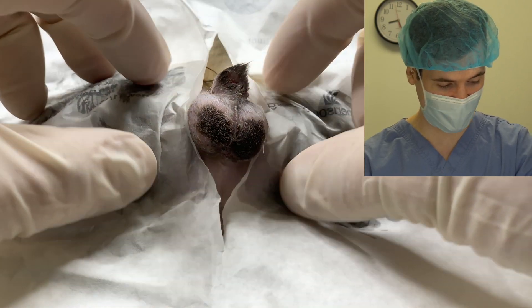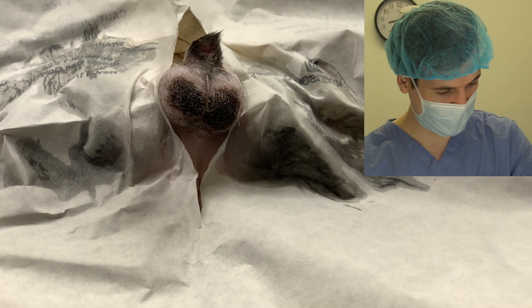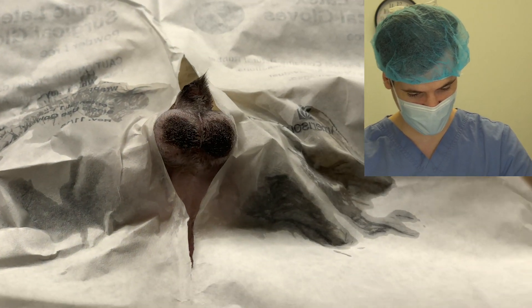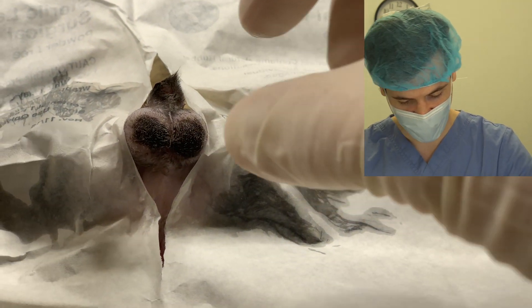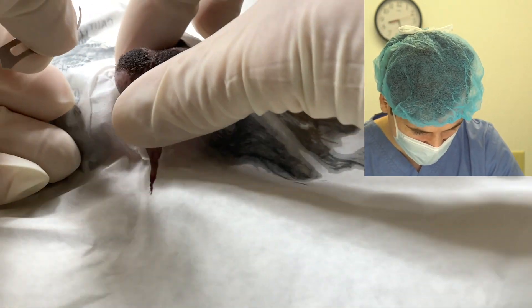We're gonna begin. This is a closed castration, so I'm not actually gonna enter his abdomen at all. The first thing we're gonna do is make one slit on each side of the testicle. I'll start with the right testicle first and go ahead and make a little slit.